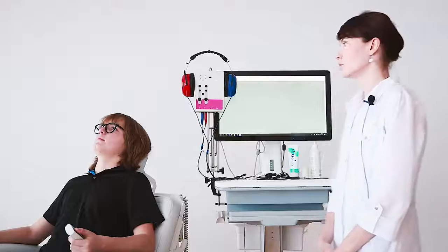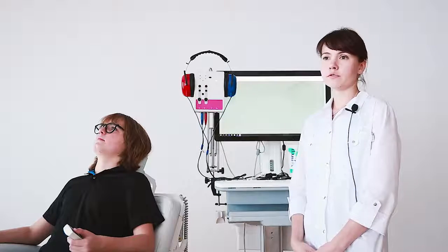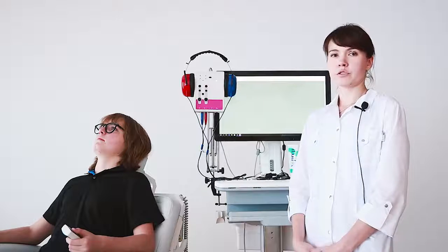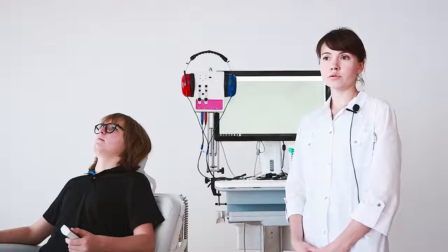Today we will use NeuroAudio as a clinical audiometer. Actually, NeuroAudio allows us to perform pure tone audiology using different types of stimulators. For example, for air conduction study, we can use headphones or insert earphones. Insert earphones have some advantages. For example, they can prevent collapse of the outer ear canal and reduce the environmental sound intensity by 30 decibels.